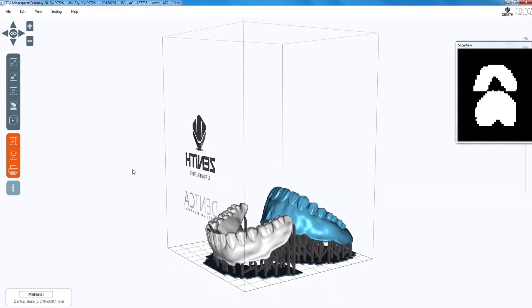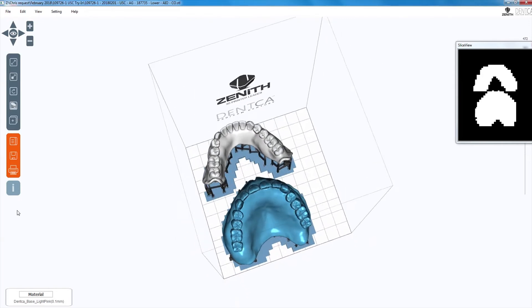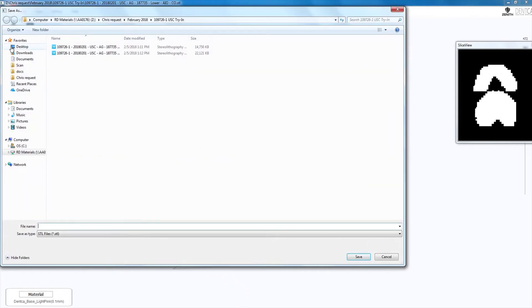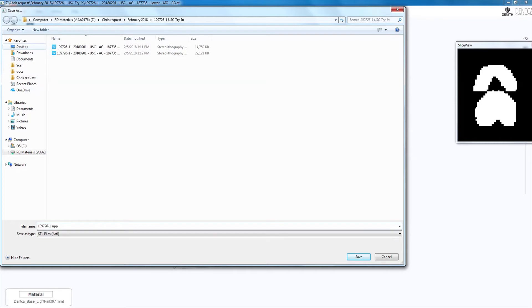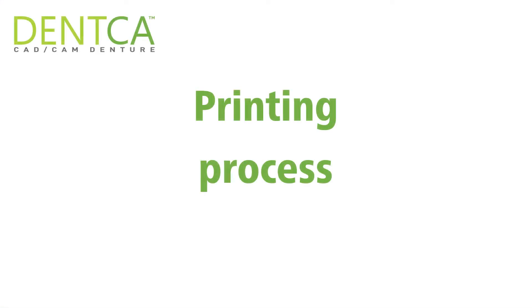When finished, your design files should look like this. Printing process.